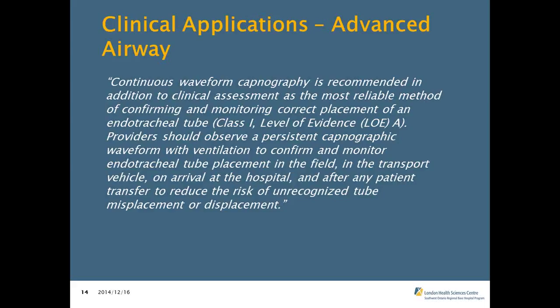a couple of studies have discovered that in patients who are intubated using end-tidal CO2 monitoring, we can directly notice whether the tracheal tube is in the esophagus and confirm that we're ventilating the patient properly with 100% sensitivity and specificity. So that's the first application we want to talk about.